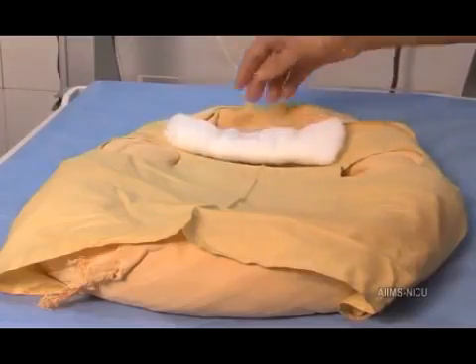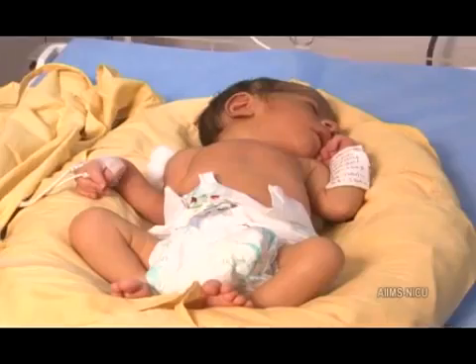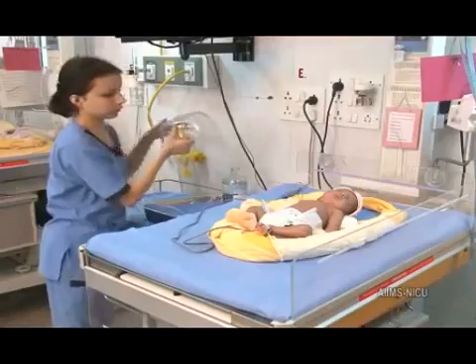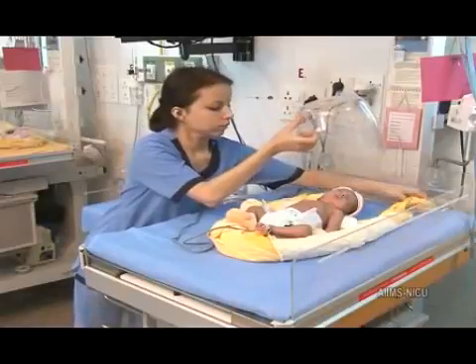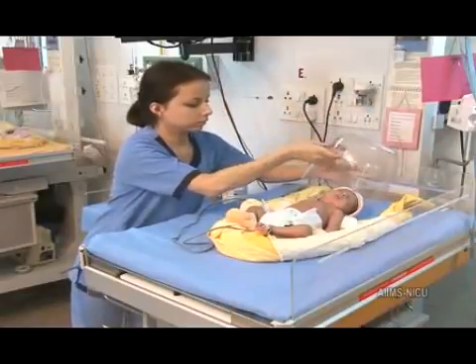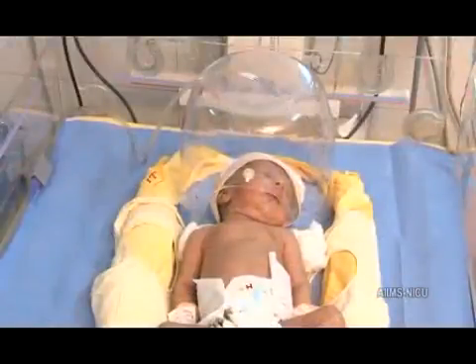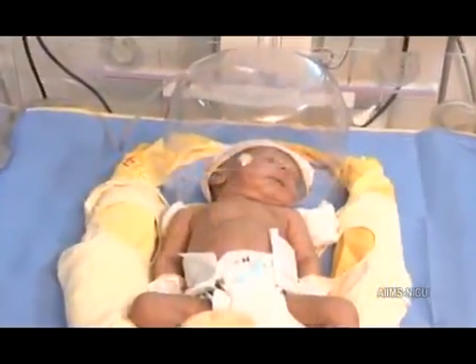Now, position the baby's head in the midline and keep a shoulder roll to keep the neck slightly extended. Keep the clean hood over the baby's head. The opening seen in the front portion of the hood should be kept at the level of the neck of the baby.